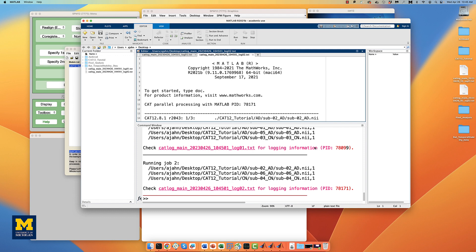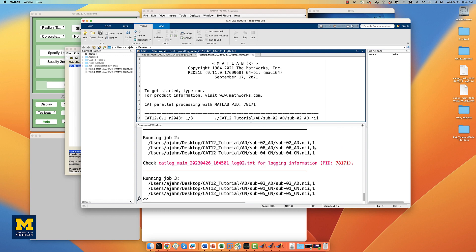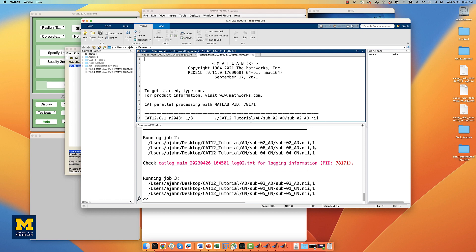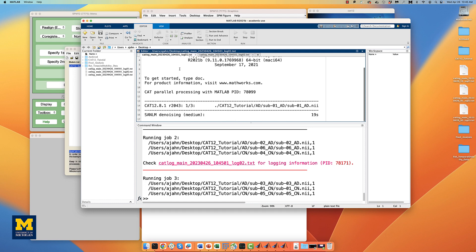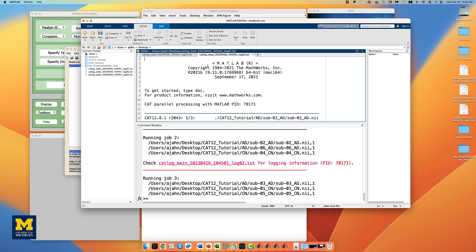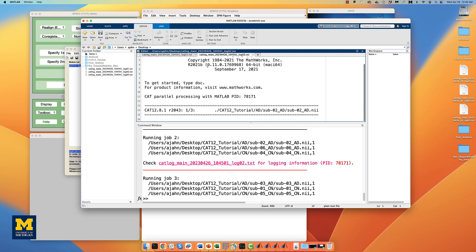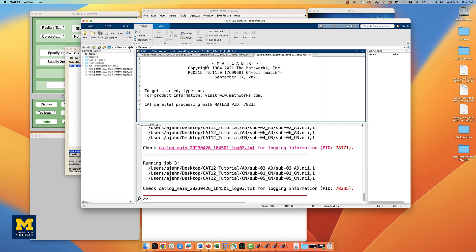You may also note that each processor's log file is also open in the MATLAB editing window. Click between the different log files to see how they update as the data is analyzed. This will take a couple of hours, and we will come back to it when it has finished.